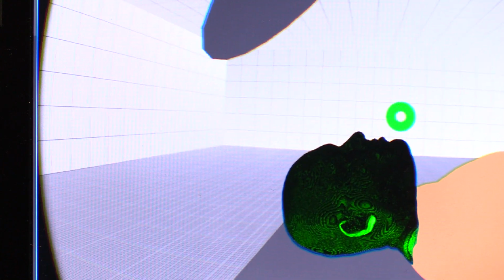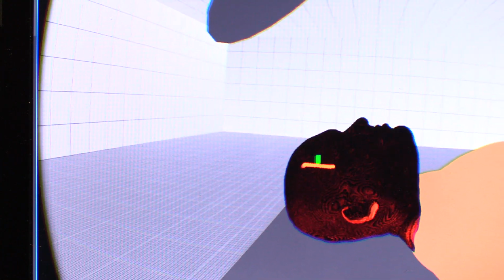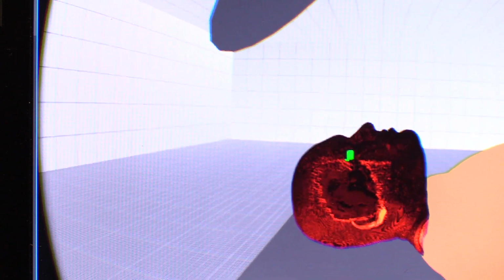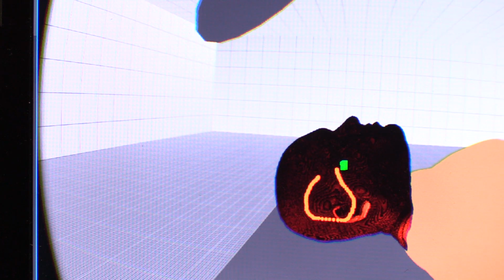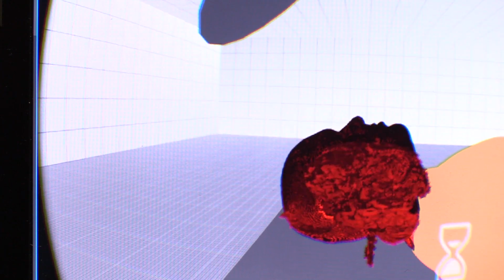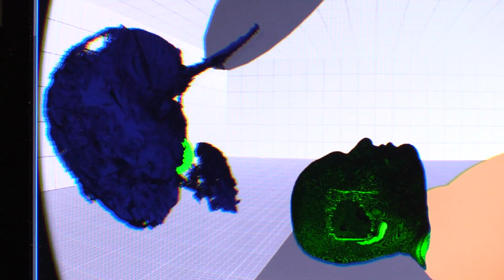Now, as a surgeon, I can practice planning my route by cutting into the MRI model, and I can determine by making cuts what's underneath where I'm attempting my cut. If it doesn't work out, I can reset it and I can try again. Now, having done this, if I see something of interest and I think that I need to get a closer look, I can then extract a component such as this brain, and we can take a very close look at it. Now, this brain, as you can see, we can rotate and get a very clear view of each piece of it.